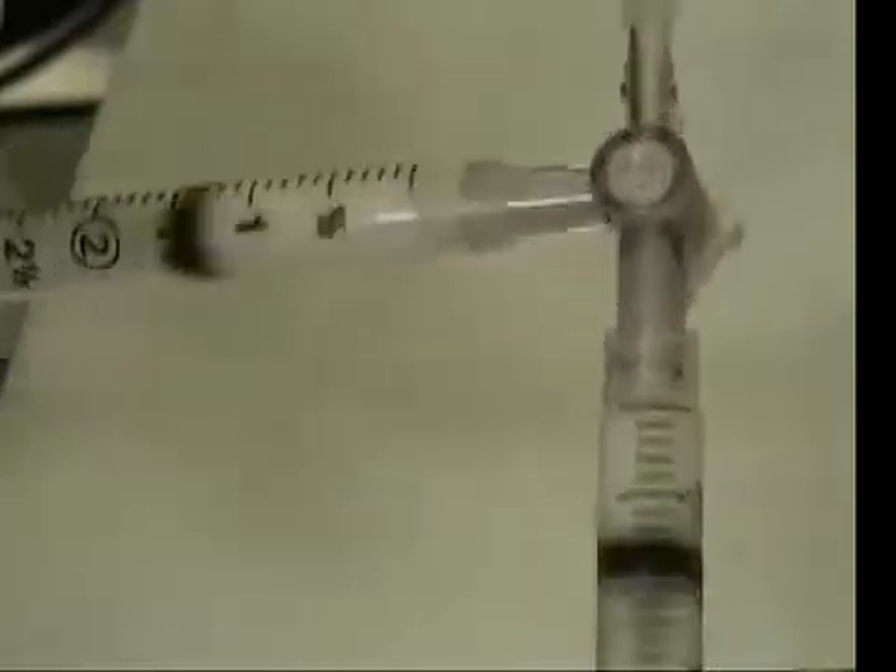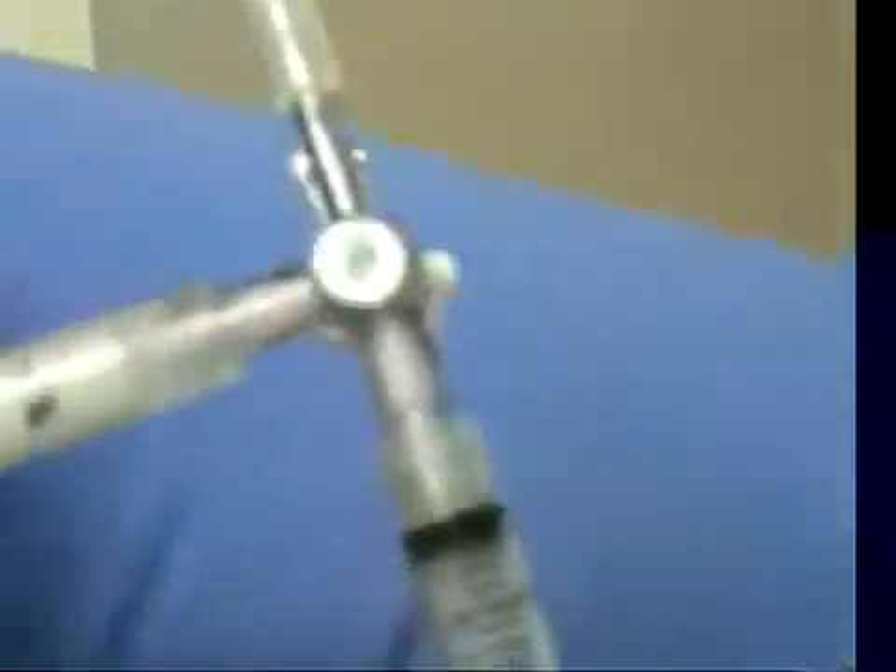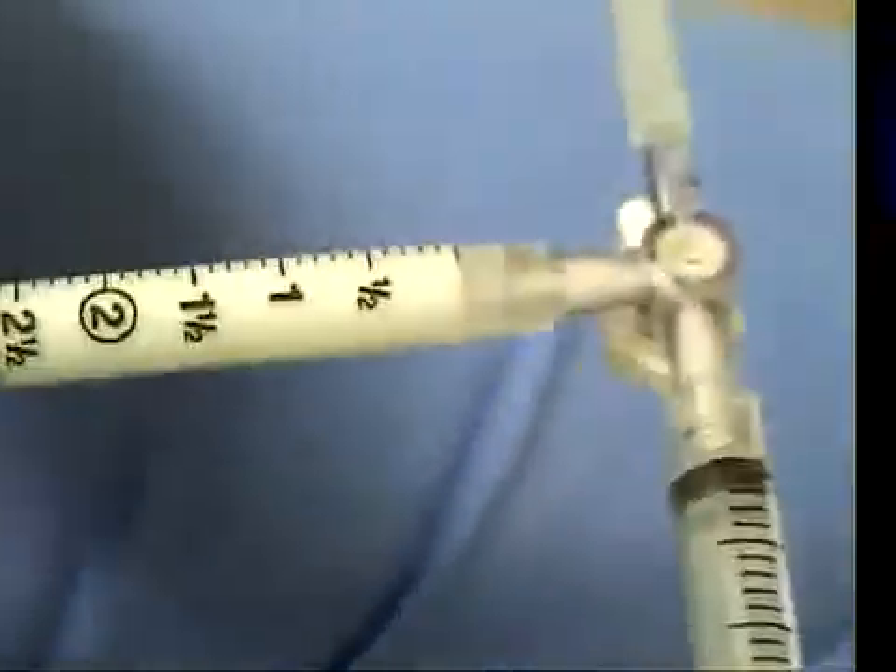I'm going to show you the blue sheet. The white foam is not showing over the white sheet — there we go, that shows much better.